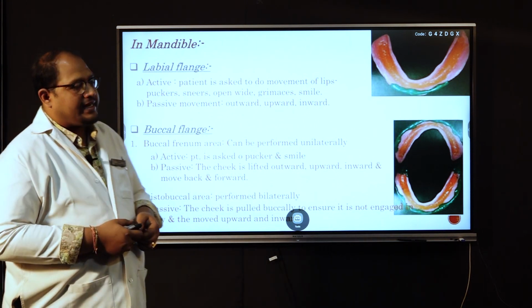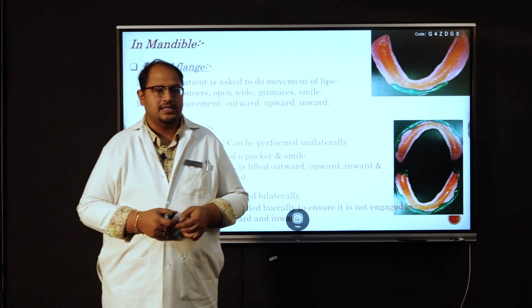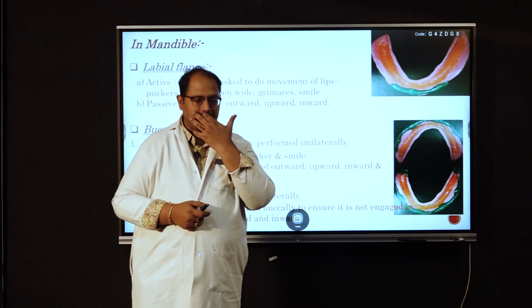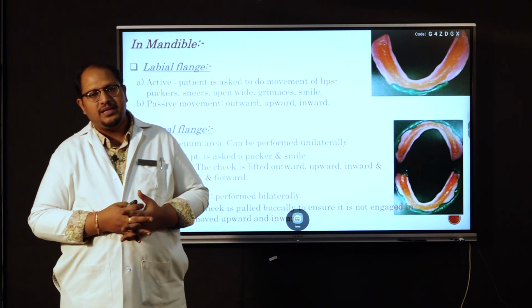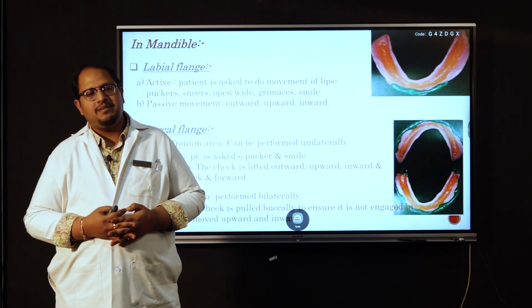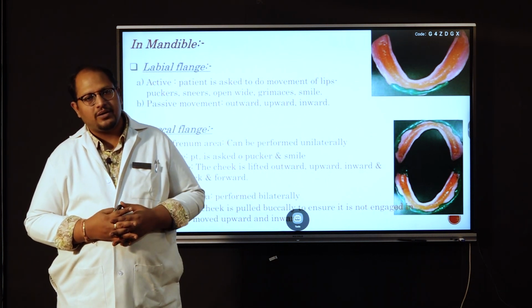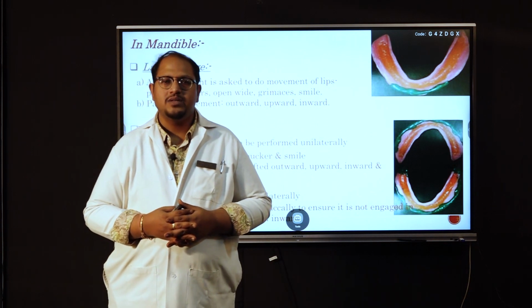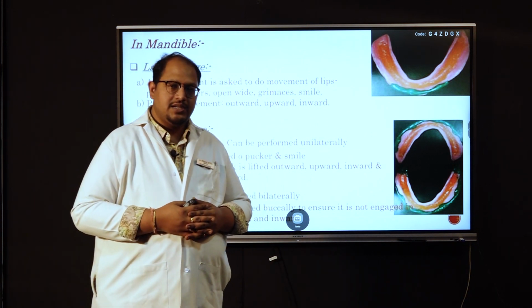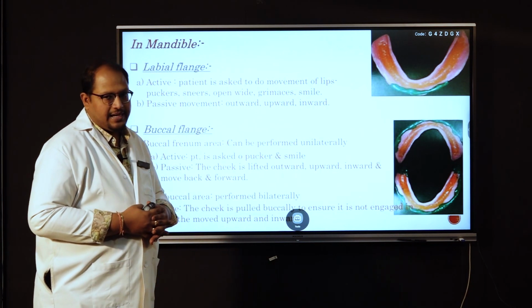So there are different techniques and different books which speak about how we are supposed to do mandibular border molding. Some people prefer to start from the labial section of the denture. Some people ask to start from the lingual. Some people say that the retromolar pad should be recorded first. However, the clinician can go ahead with whichever is comfortable. We will speak about how to record each section first.